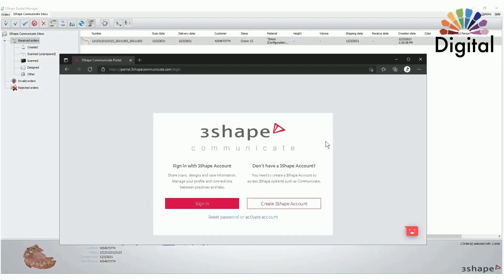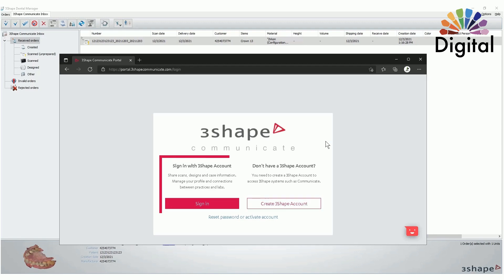This video is for Three Shape Trios, two dental system, single crown design, and model build. First, you need to make your own Three Shape Communicate account. Once you have it, your support team will help integrate it into your Trios and also dental system.